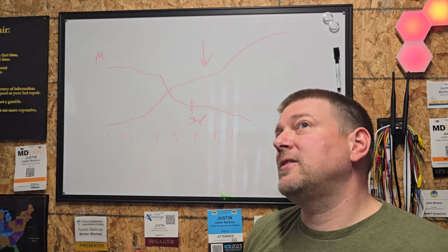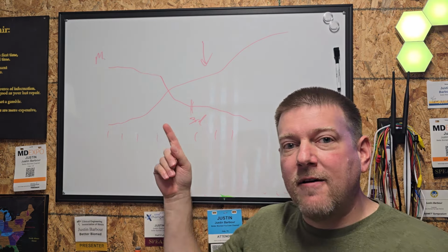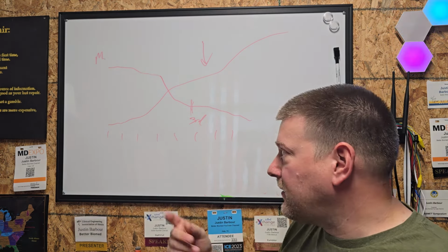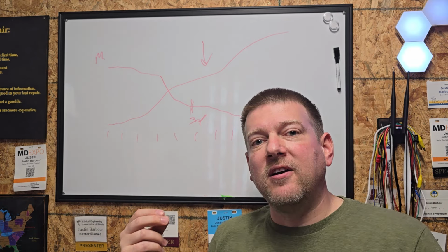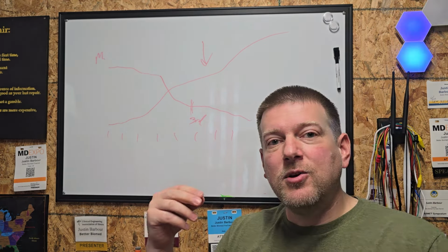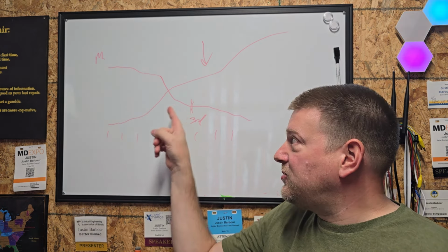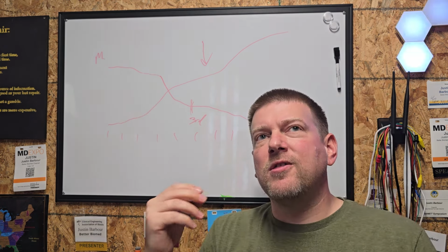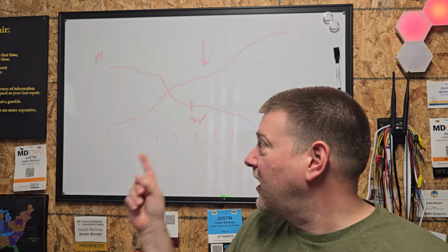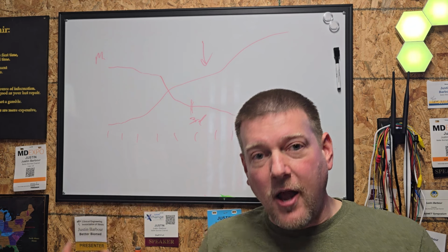They don't sell parts, they don't sell service, but as years go on and you have a lot more people with experience with the product, you have more people that are experienced in repairing it, so your repairability goes up. You can source more parts. As more items end up on this sweet spot right here in the middle, we're talking 3 to 8 years of life cycle. 3 to 8 years of a device's life.